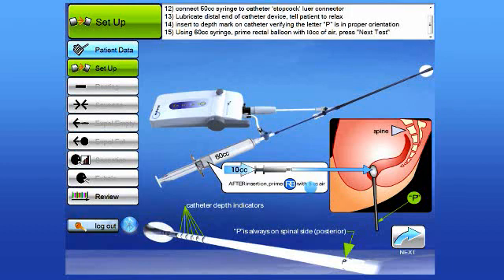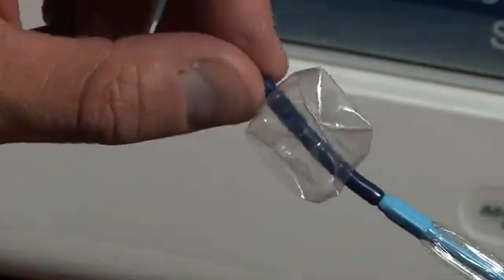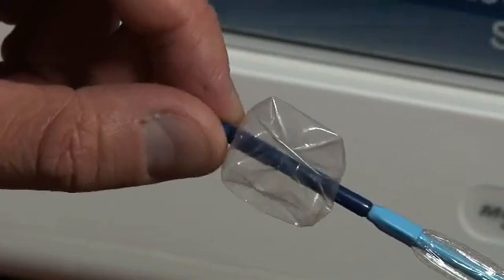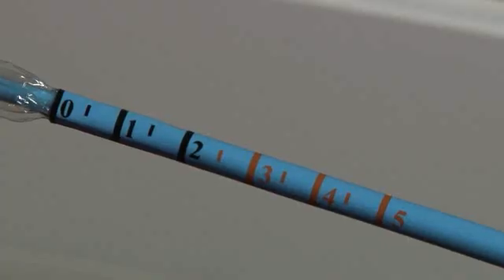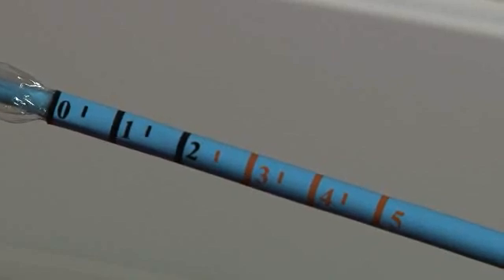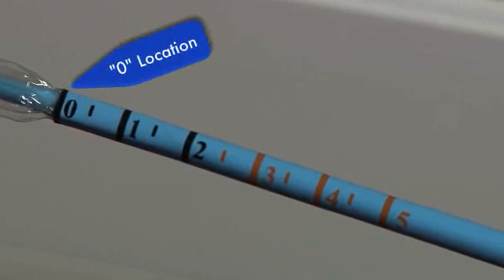The instructions remind you to lubricate the distal end of the catheter device and instruct the patient to relax. Utilize a standard lubricant to the distal end, the rectal balloon, and the four anal canal balloons. The catheter features a soft, flexible tip, but has enough strength and firmness to be inserted without the use of your finger. Gently insert the catheter through the sphincter to the point where you would be located at the zero location on the catheter.